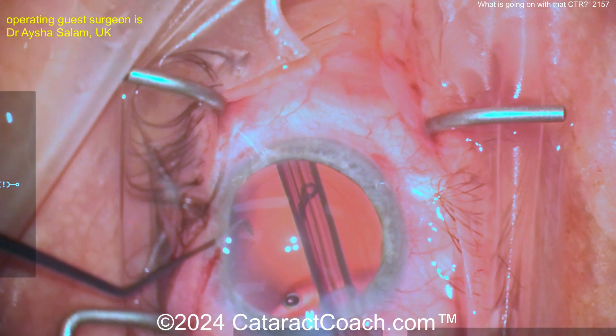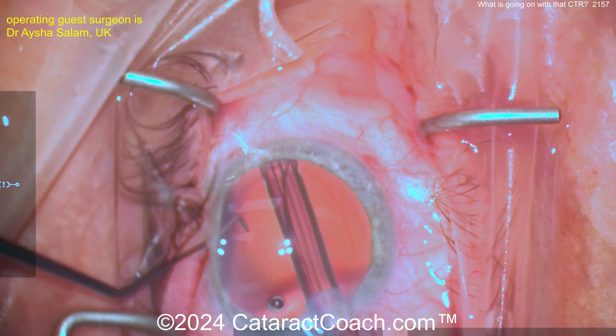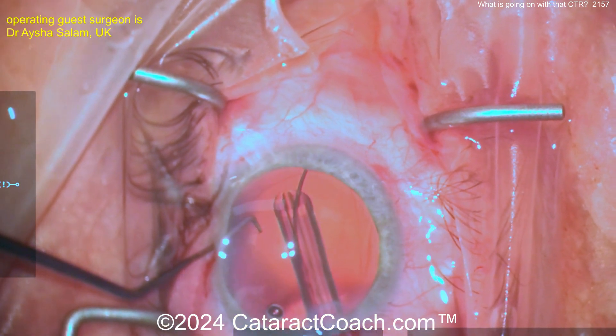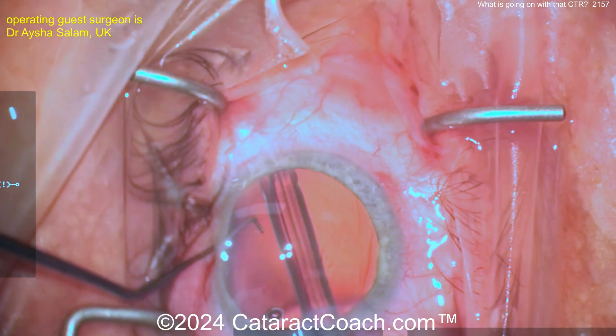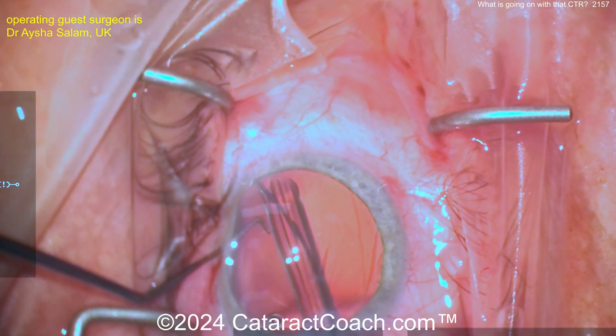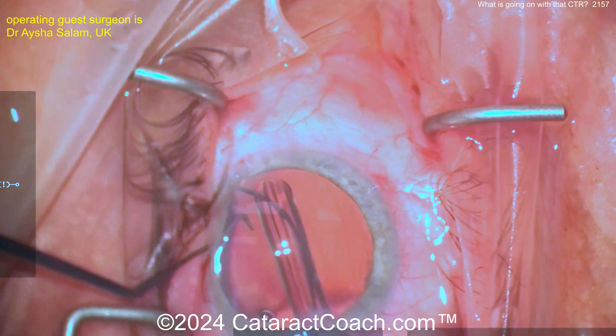Now look at the direction it's pointing — that way. The surgeon is implanting it straight ahead, so remember how weak and wimpy that capsular bag is. You keep injecting, you want this to go around the capsular bag equator, but it doesn't look like it's going there because now it's turning the other way.